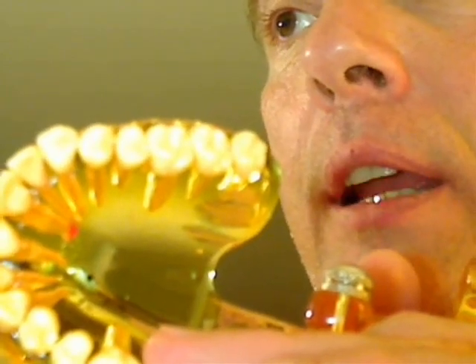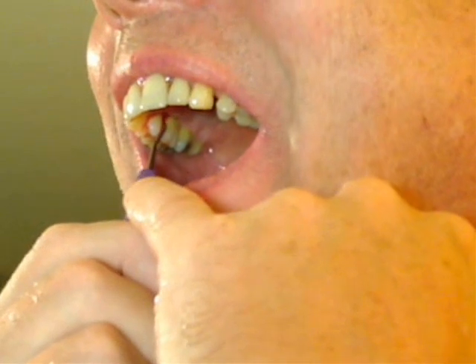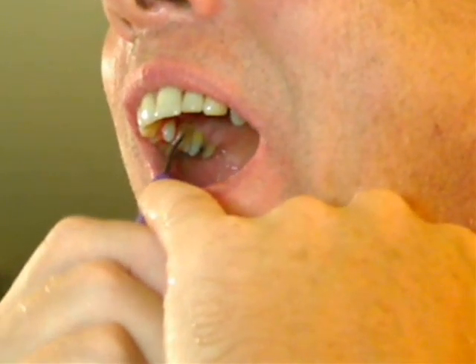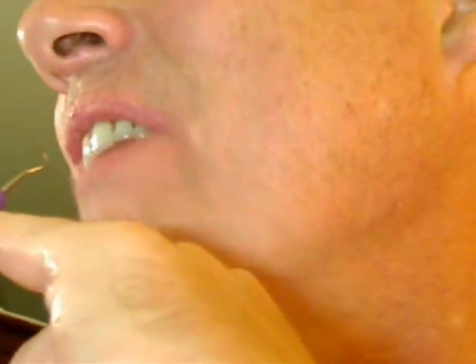Let's check these out — this is the most recent one. There's roughly about six pretty good-sized blobs, plus two that are pretty gigantic. If you look at the model, this is the uppers — you can see that the molar right there is flat. This is a very tedious process. I'm working from the back. When I find this stuff, it just starts to bleed, so I don't have to do that much thinking. I take the point and try to loosen it, then scrape it smooth. Then I go in deep along the bone.